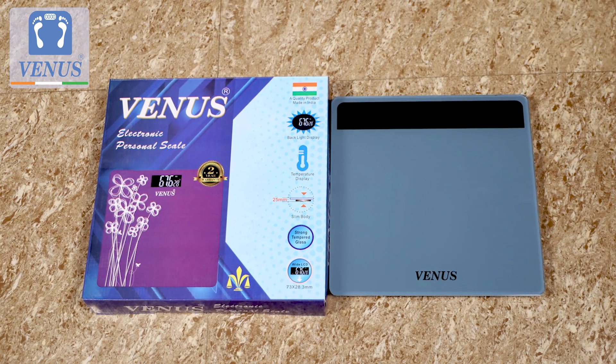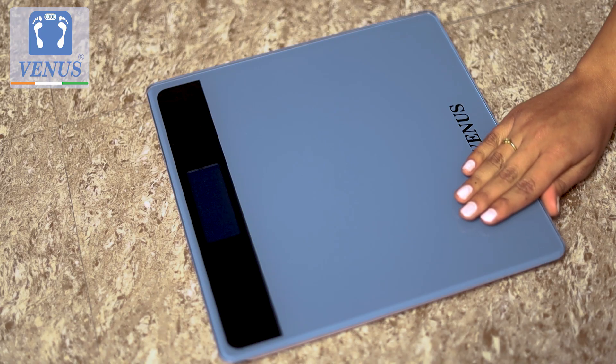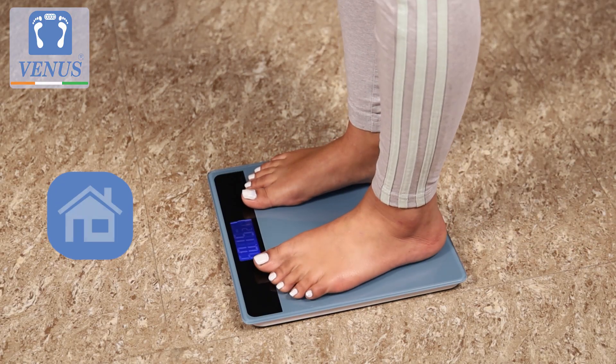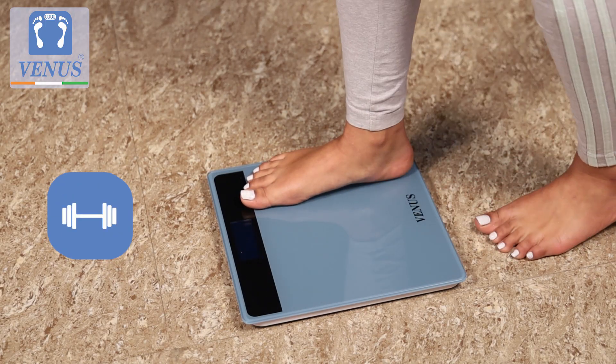Introducing the Made in India Venus Body Weighing Machine, the simple, easy and reliable way to monitor your weight at home, office, gym or a clinic.